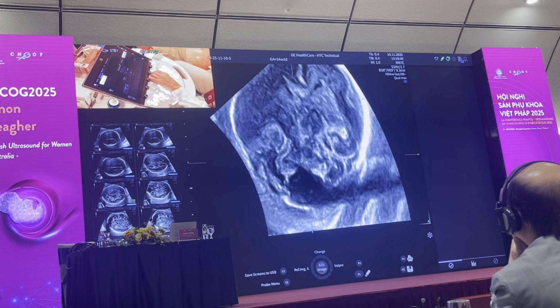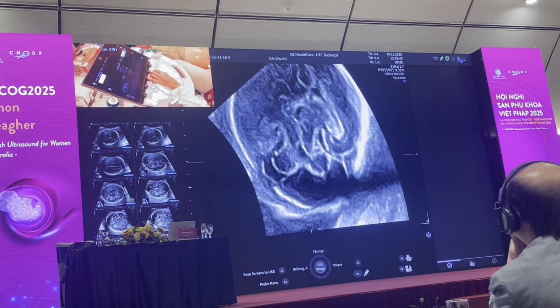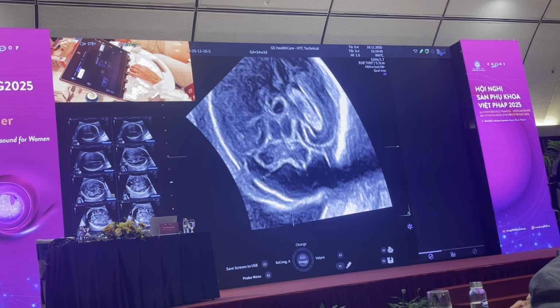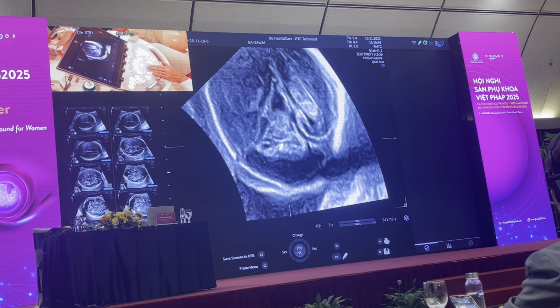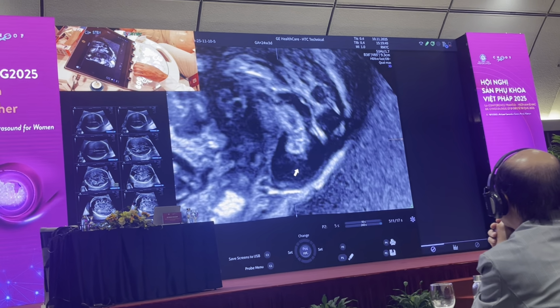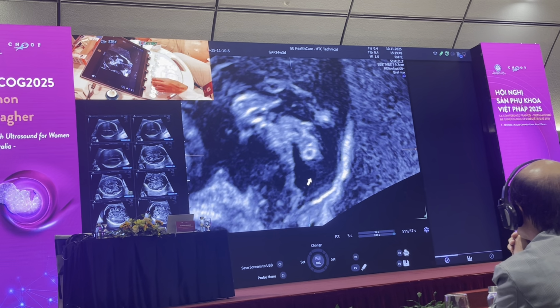And as I do that, I rotate through the volume just to look at the rest of the body of the baby. So the cerebellar hemispheres to me are normal. I cannot see any reduction on either side. Once I get to here, I see the ridges of the cerebellum on the side here, which looks normal form. And then as I come across that, I can rotate on the y-axis. And now I get a view of the vermis of the cerebellum.